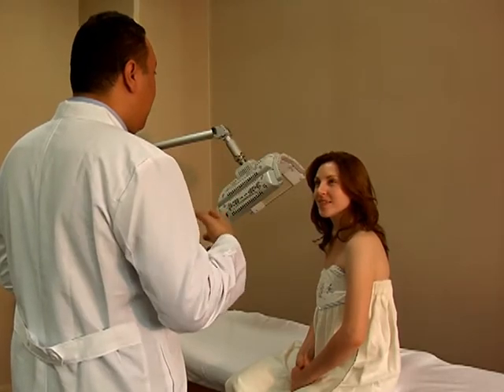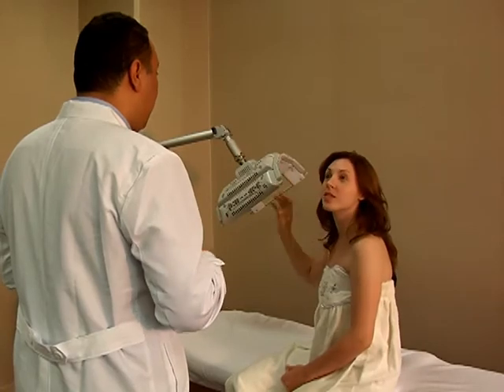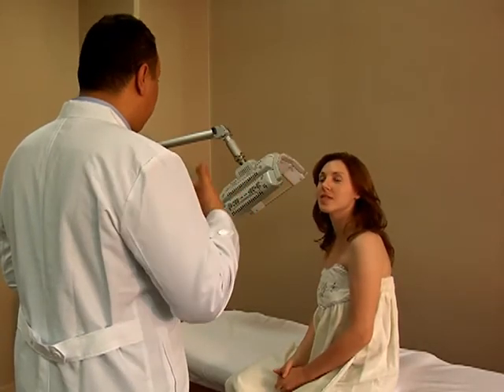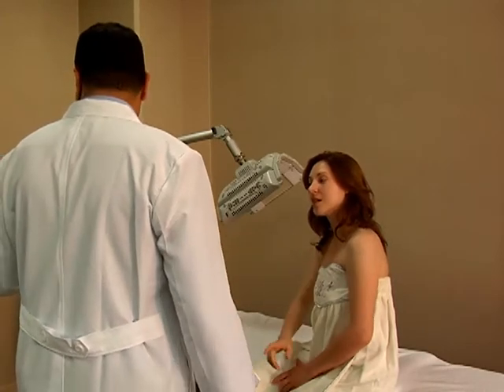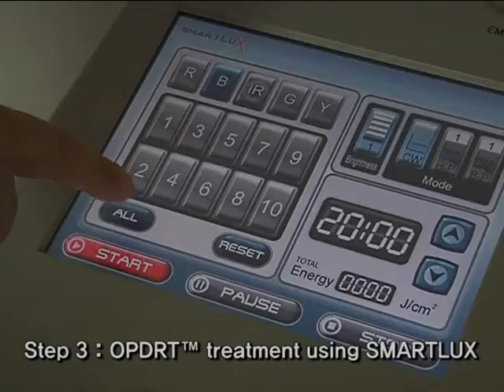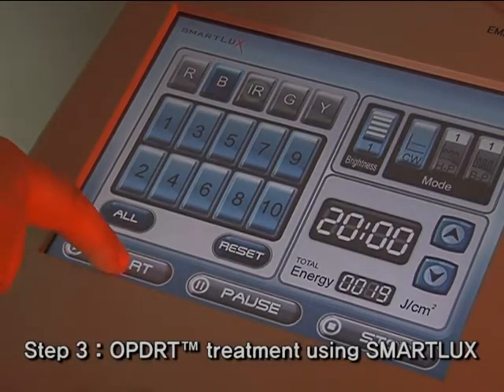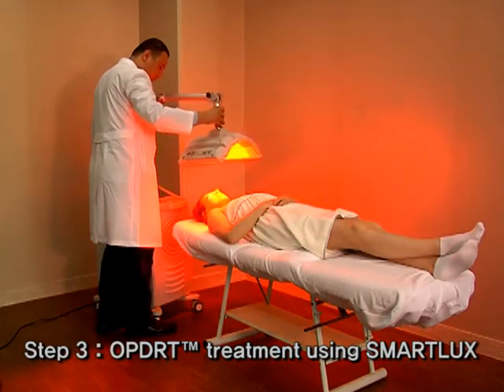SmartLux has six different colors of light, and each light is used by various indications of patients. The light will be chosen after thorough consultation with a doctor. Close inspection is carried out to find the right light for the patient. Patient must wear eye protector before exposure to the light.